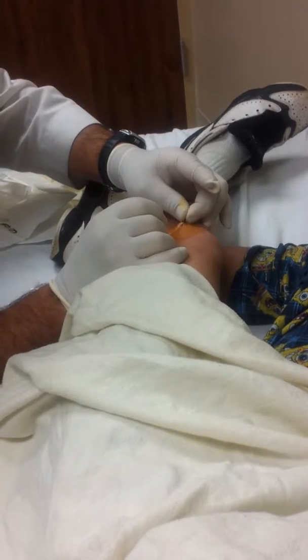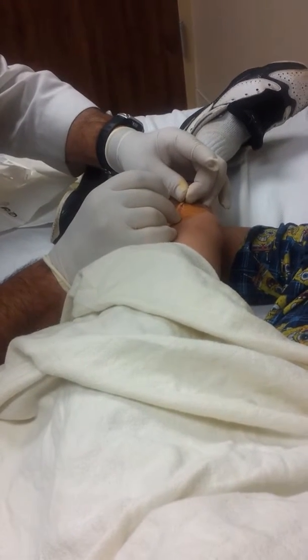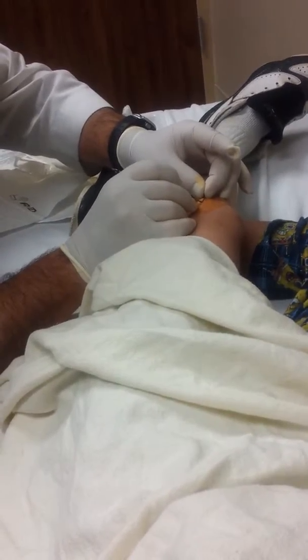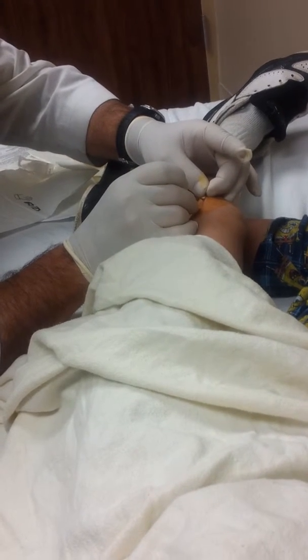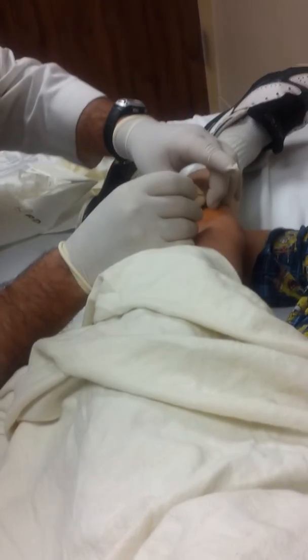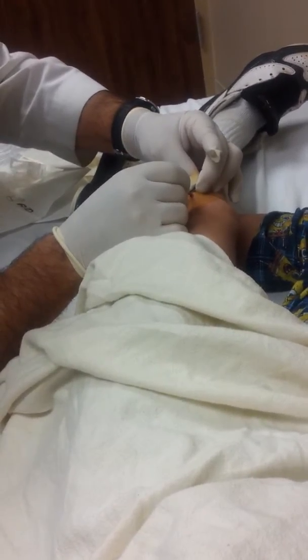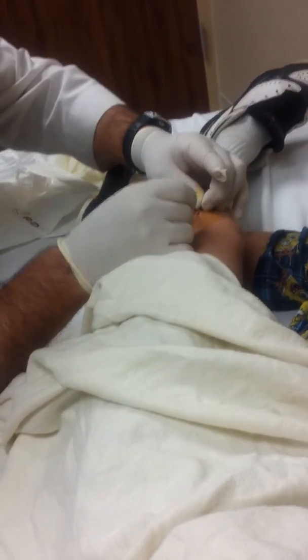You just feel it tugging. I don't know what in the world it's got a hold of in your leg. Put some soft tissue. I didn't know it still bleeds but it's numb. Yeah, but numbness don't stop the bleeding.